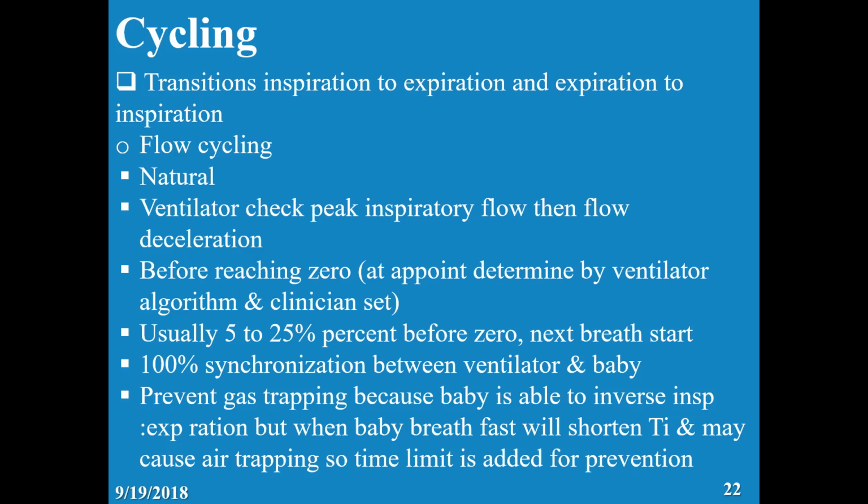The problem with that is if the baby has tachypnea and is breathing very fast, because once they breathe fast, he is driving the ventilator, we will shorten the inspiratory time. So it's only true that trapping will not happen when there is no tachypnea.